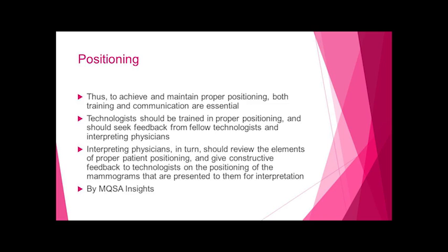I have seen some things in the last year in our consulting business, where we assist facilities if they have some sort of problem. I've seen an increase in the number of corrective action plans that require the hands-on, and each one of those has a component that talks about the communication process and how you're going to document that, and how we're going to talk about the communication between the interpreting physician and the technologist.